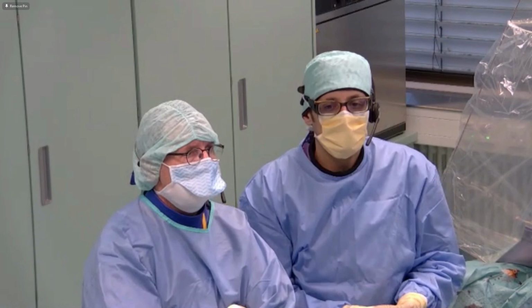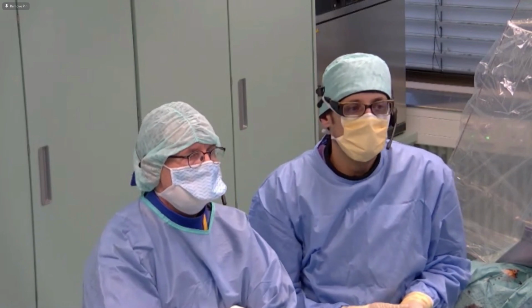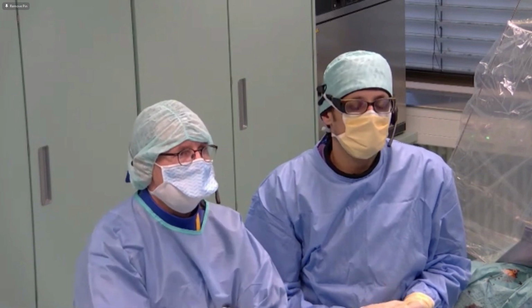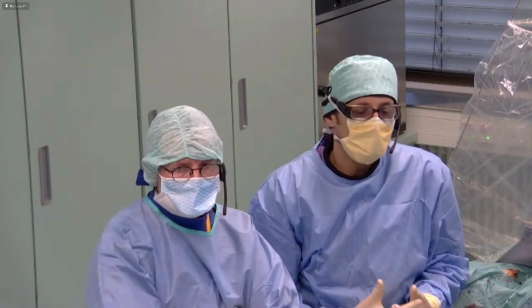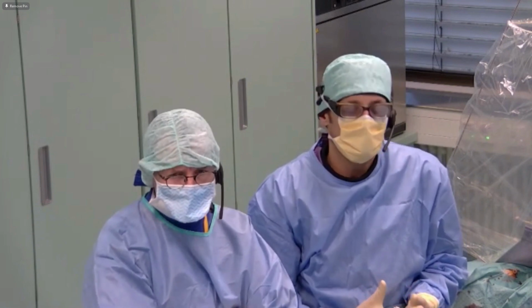Regarding other complications, the only thing, but it's not a complication in my point of view, is that sometimes you see not only disruption, but the disrupted plaque may also result in a dissection. In a very calcified lesion, this is a good sign. It's not a bad sign, right? Because once you have a dissected calcified plaque, you know that the plaque is modified in a very good manner.